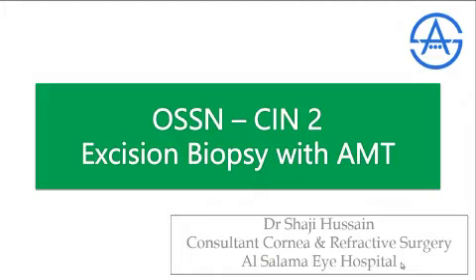Presenting a case of an ocular surface squamous neoplasia, which on histopathology report turned out to be conjunctival intraepithelial neoplasia type 2, for which an excision biopsy was planned with an amniotic membrane transplantation. This was a 54-year-old lady who had presented with a lesion that was irregular, vascularized, and getting pigmented for the past 6 months.